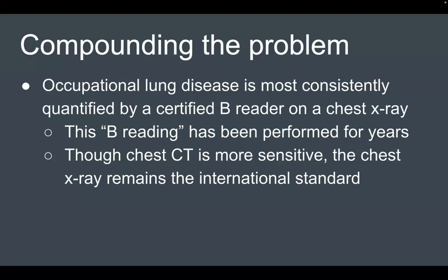So there is a whole program in the United States called the Certified B Reader Program. These individuals are primarily radiologists, but also occupational medicine physicians who are certified to read these chest x-rays. Although chest CT is a much more sensitive modality, chest X-ray remains the international standard. Next slide.